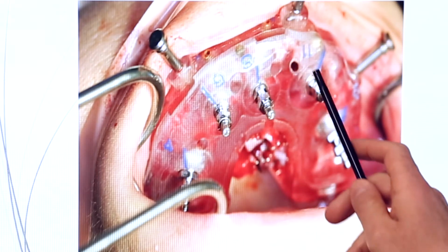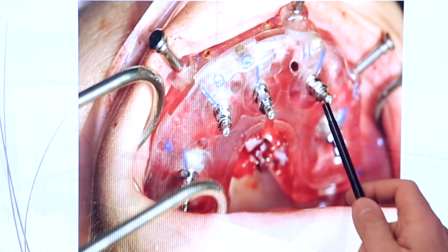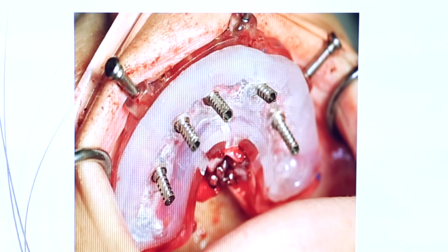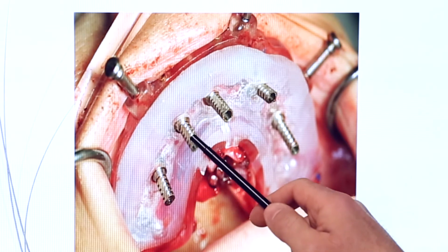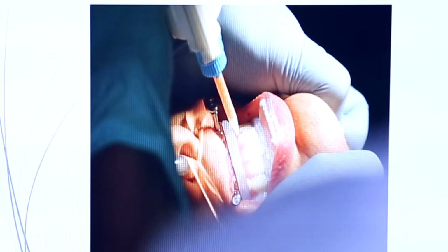So this is the picture during the surgery, and here we can see the custom-made computer-generated implant guide that again allows for a specific placement of the 5 implants in very strategic spots to maximize the success of the subsequent prosthesis. This is the picture that shows attachment of what we call transfer copings. So these are little metal cylinders that are attached to the implants, which are now inside of the bone. And the reason for these transfer copings is that they now allow the prosthesis or the teeth to be attached to the underlying implants.